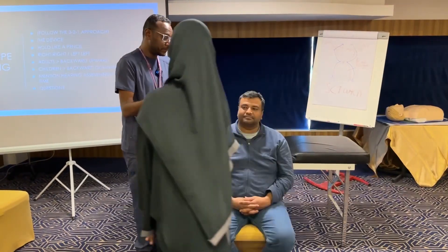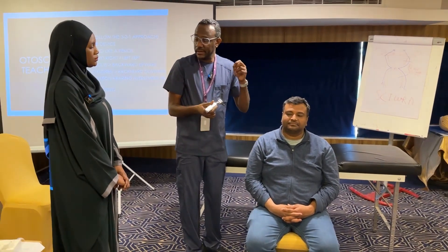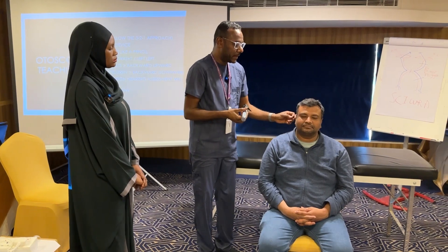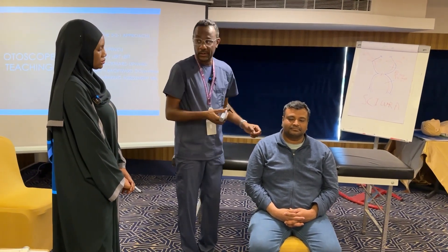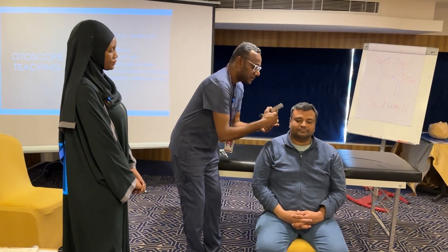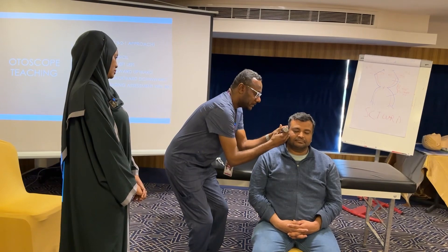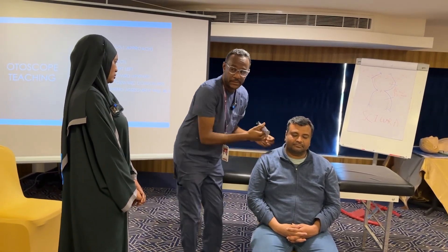Which ear is painful? So we'll start with the right. I'll show you how to use it. First, we need to straighten the auditory canal. So we'll pull the external ear backward and upward in adults. In children, that should be backward and downward. Stabilize the little finger on the cheek, and then you will insert that part and look to assess the external auditory canal and the tympanic membrane.